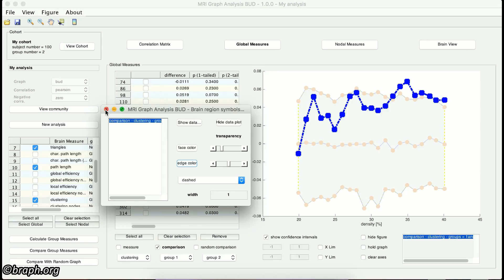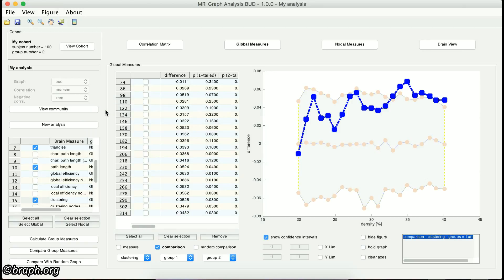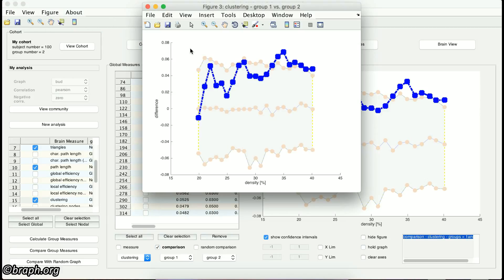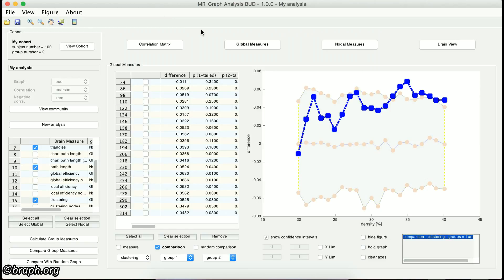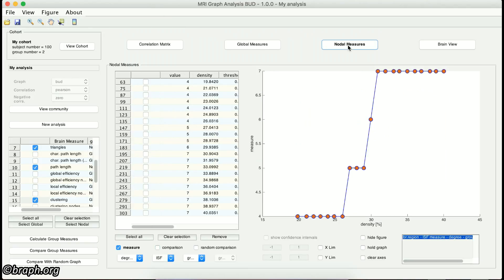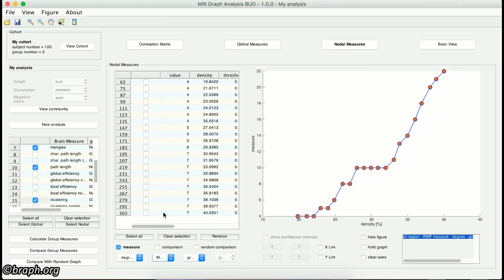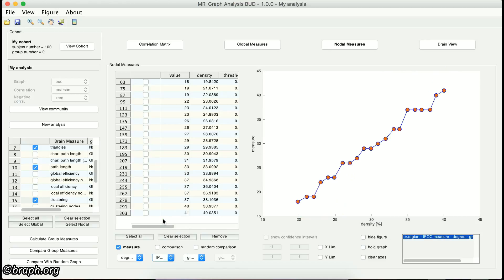If you want to export this figure, use the Generate Figure option below the figure menu. If you go to the Nodal Measures panel, you can see that the only difference between this panel and the previous one is this drop-down list, in which you can select the regions whose analysis results you want to observe.